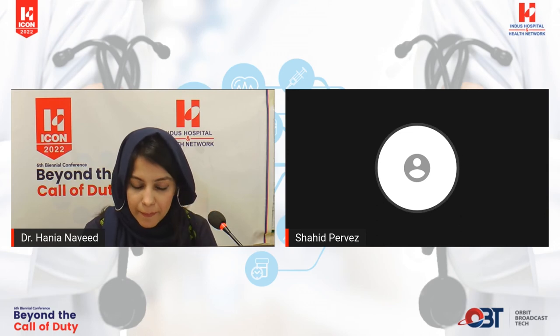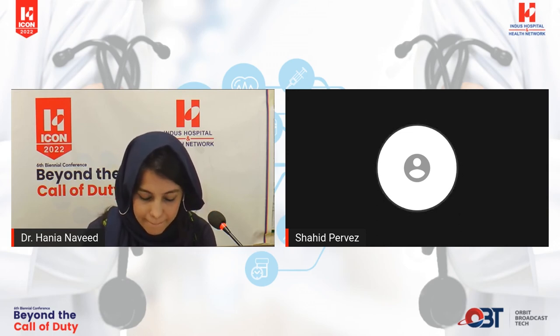Yeah, that's obviously challenging, and to make a definitive diagnosis in many cases will be difficult. Many of such core biopsies eventually may be reported as features suggestive of small B-cell lymphoproliferative disorder, something like that.